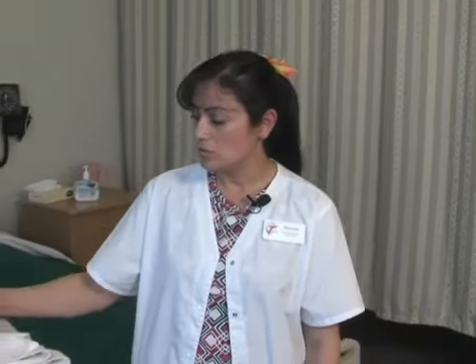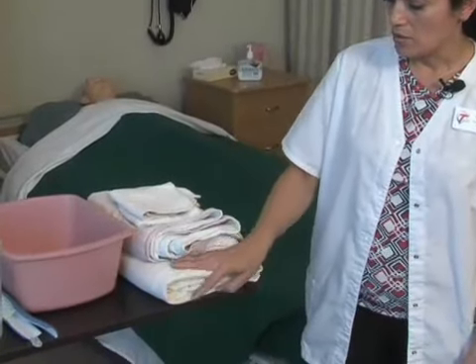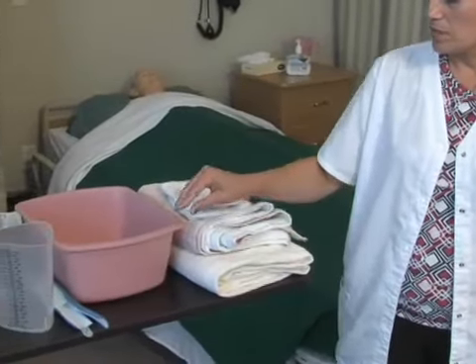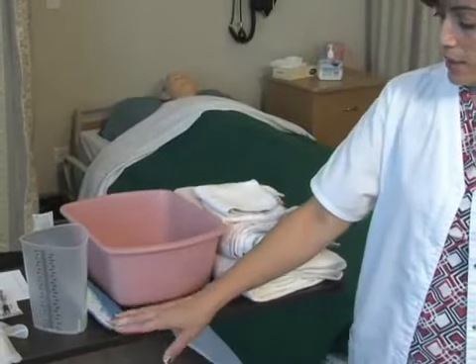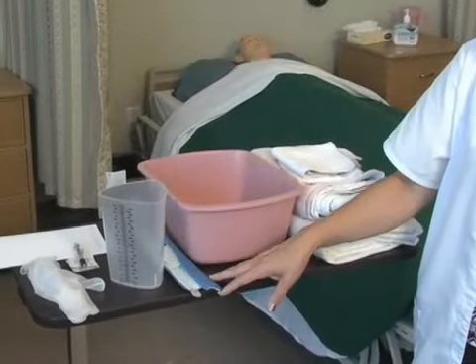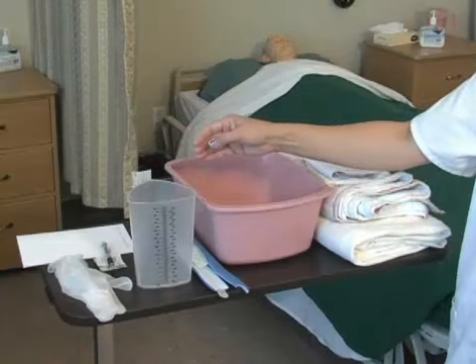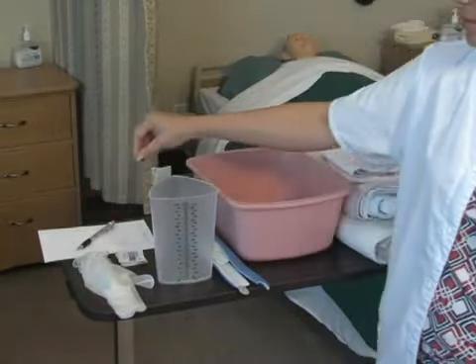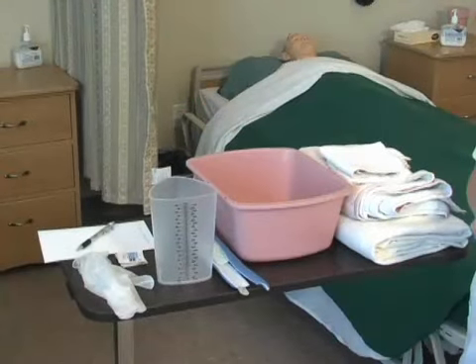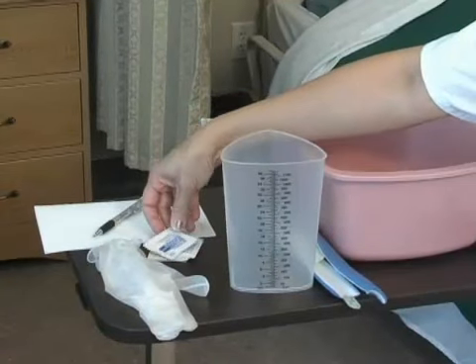For this procedure, I will need 2 towels, 1 incontinence pad, 1 bath blanket for privacy. I'll need a basin with warm water, and I need a leg strap to hold the catheter in place. I will need a graduate so I can drain the urine inside, and I'll need gloves, and then I'll need paper and pen so I can document my urinary output. You will also need some alcohol wipes.